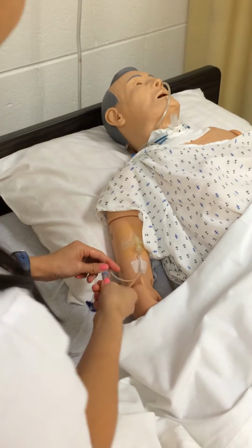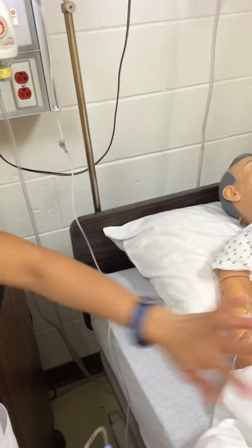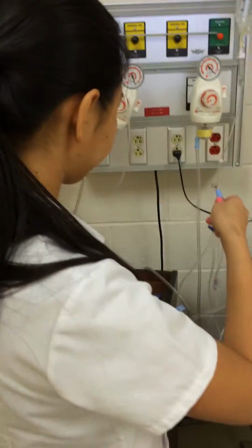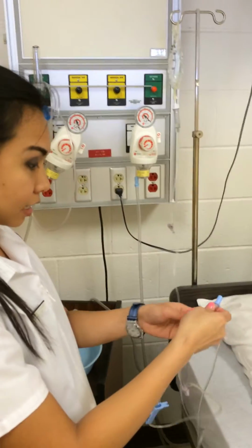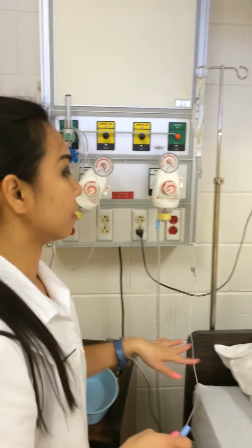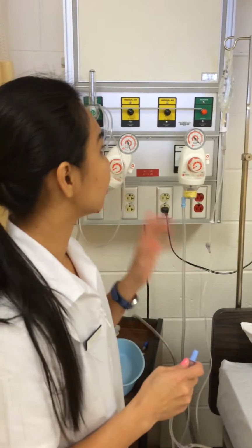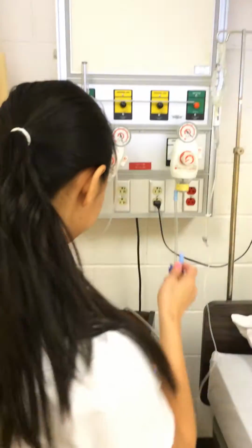Because this is validation, I'm not going to put it in the reel because it's going to wet the bed. After I connect it, I just unclamp it, and the patient will get the IV at 60 drops per minute.